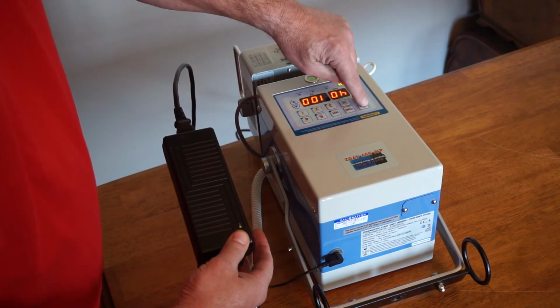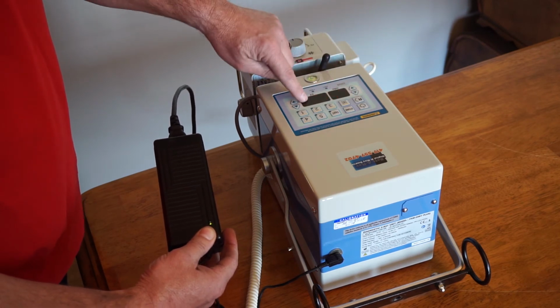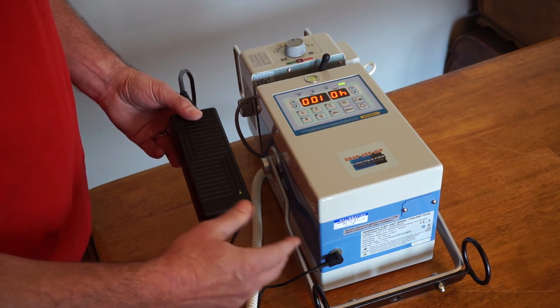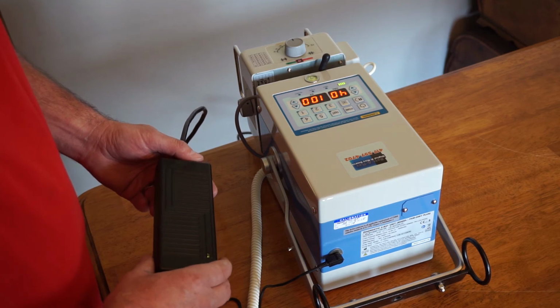You could check your battery percentage by turning the machine off. And the first number that flashes on is your battery percentage, and that was 94. So keep it plugged in till it's at 99 or 100.